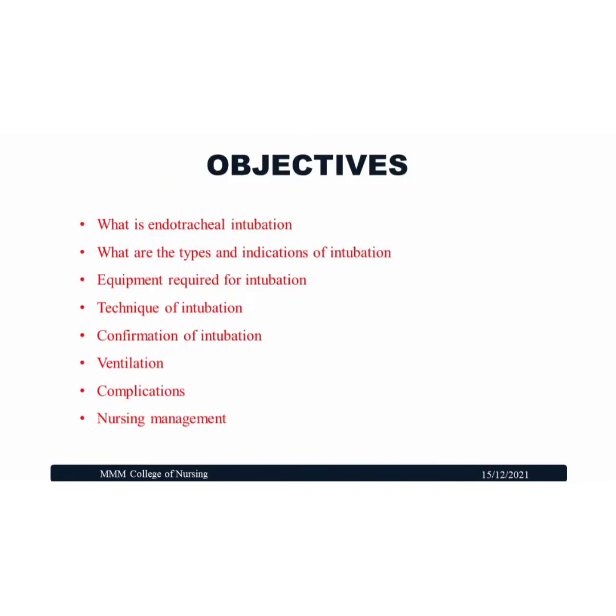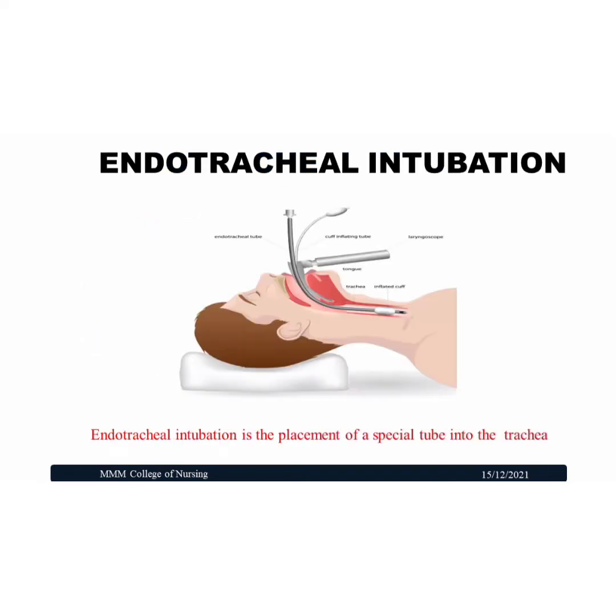Let's see the objectives of the topic. What is endotracheal intubation? What are the types and indications of intubation, the equipment required for intubation, the techniques of intubation, the confirmation after intubation and ventilation, the complications of intubation, and the nursing management of intubation?